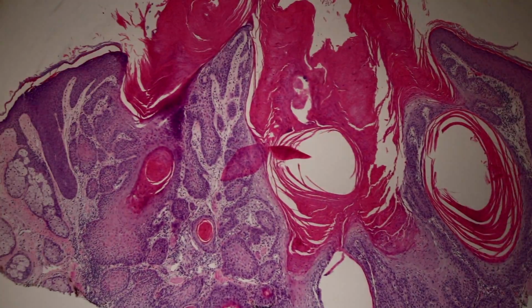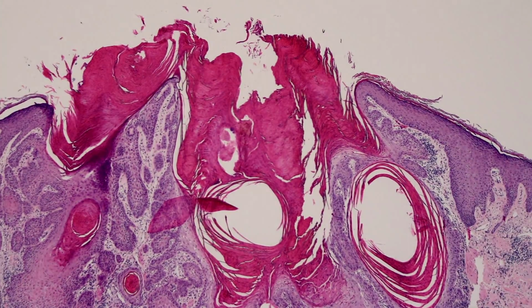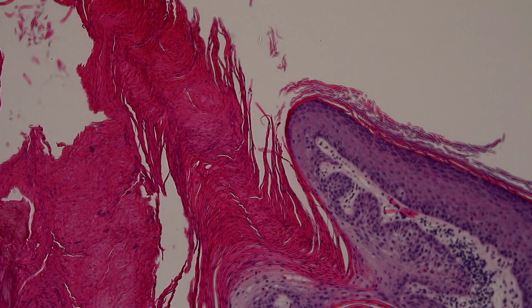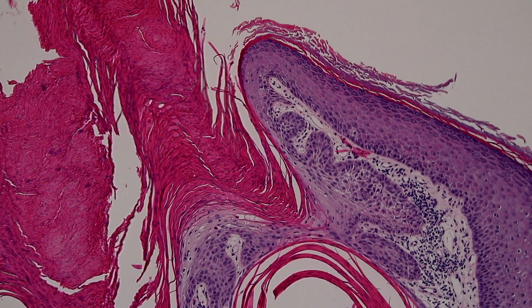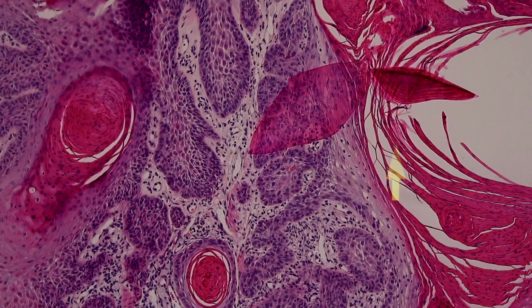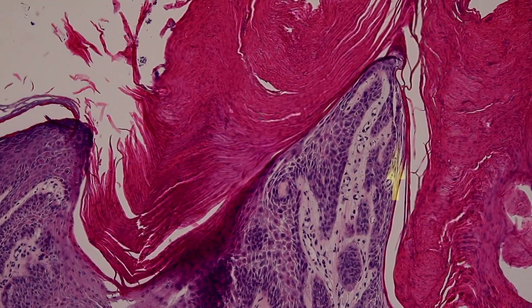And usually there's a connection with the surface, although it's not always obvious that there's squamous cell carcinoma in situ over top. For example, look up here. We can tell there's invasion down below and that the lesion connects to the surface, but the surface here really looks just reactive. It has a lichen simplex chronicus change from chronic scratching, rubbing and picking at the lesion, with a thick granular layer but very minimal atypia. There's no AK or squame in situ here, and yet we have invasive squame. So there's not always a stepwise progression from AK to squame in situ to invasive squame. A lot of times you really don't find much overlying precursor lesion.